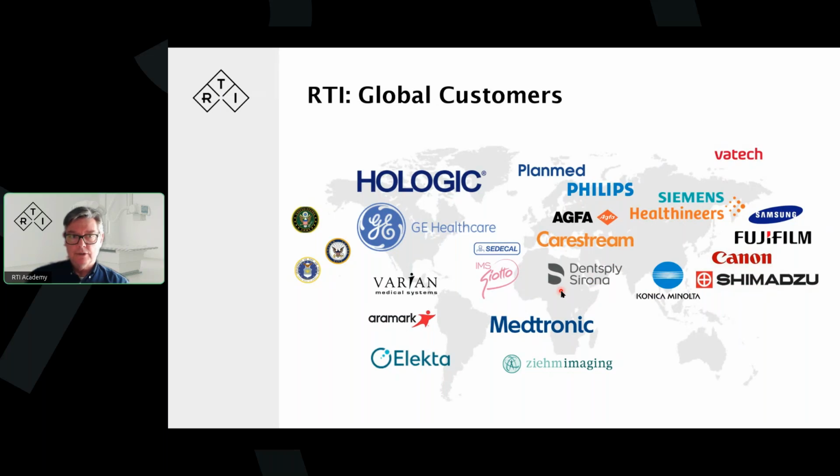Previously, they're using the Piranha for the KV and dose measurements and HVL. And with the scatter probe, they're then checking the leakage of their DEXA machines and also their machines going off the manufacturing line at the end of line testing.